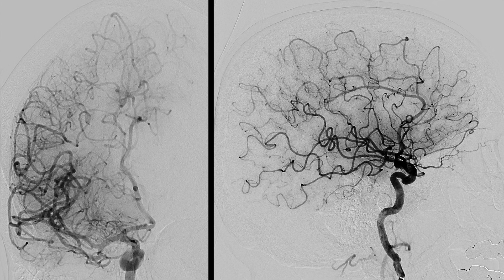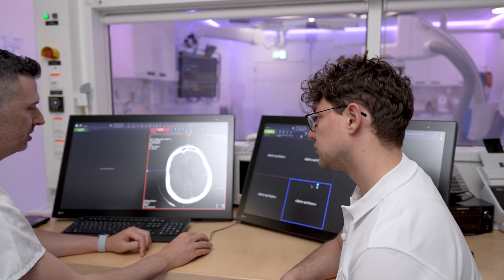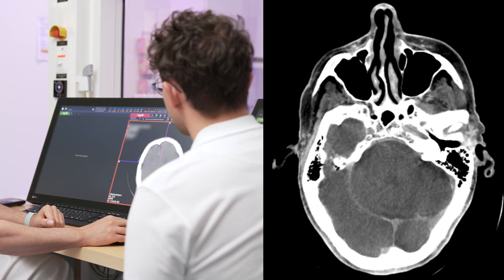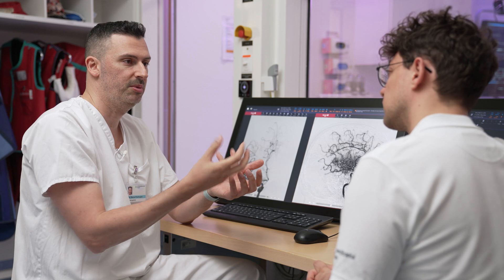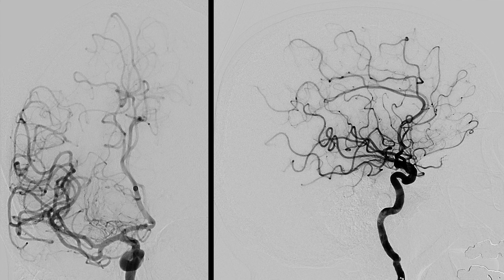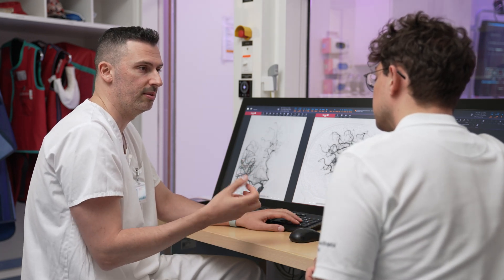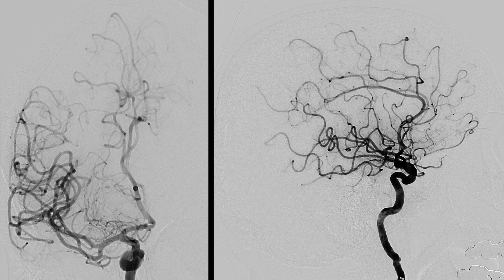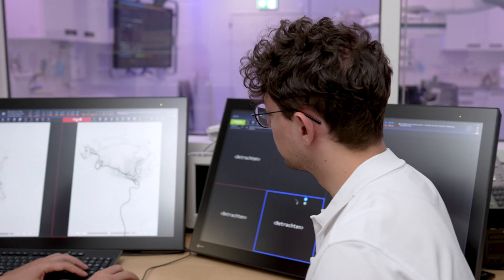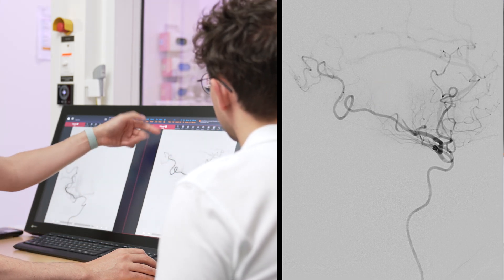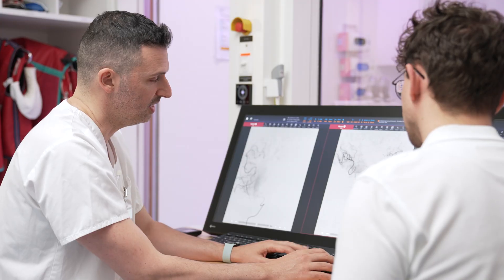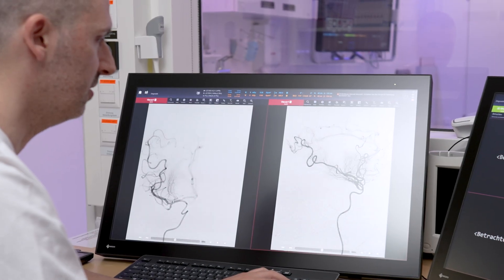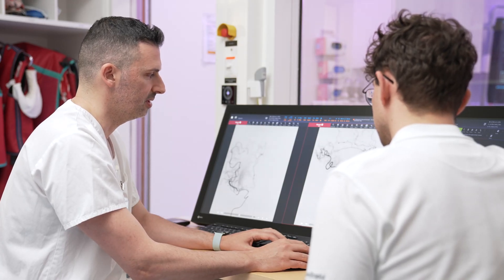You can see we have full reperfusion of the whole territory. On the CT from this patient, there wasn't any bleeding on this side of the brain where we worked. So altogether a really good result. Sometimes don't stick to the rules — you have to check the anatomy, understand the anatomy, and try to adapt to the case. In this case it's a pretty interesting anatomy: you have an early bifurcation, but the inferior trunk — which is usually the bigger dominant one — is in this case smaller, and you have a really big superior trunk. This is a branch from the superior trunk that goes all the way to the back of the post-central region, and you have the occlusion of exactly the branch that feeds the central region. For us, we wouldn't leave something like this.